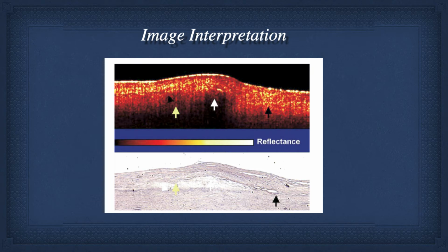Now when we go up to the OCT image where the lookup table is orange here, the border is diffuse, and so by that criteria, this would say, well, we're looking at a lipid plaque, not a hard necrotic core, that we're just losing signal. But if we go just a little bit to the right, we go down to the histopathology, it's still lipid necrotic core, but we look at the OCT image and the border is sharp, which it should be between lipid or necrotic tissue and intima.